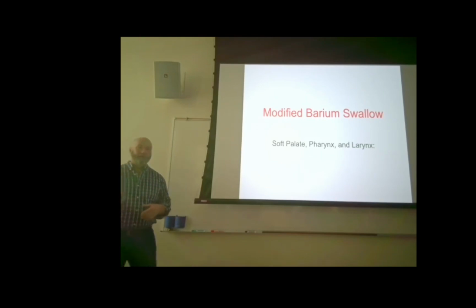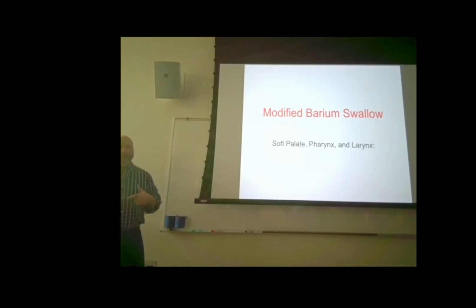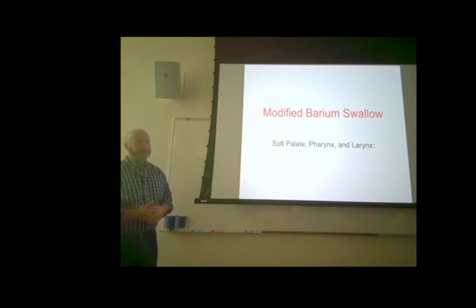The only thing we're really looking for, again, is how well does the patient swallow? Do we have any kind of spillage into the airway, so that they can make a specific meal plan for the patient, so that they're less likely to have those problems with aspiration? So that's about all that we're going to talk about on that.